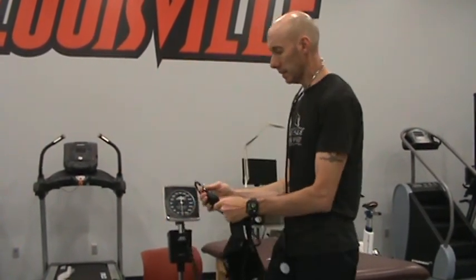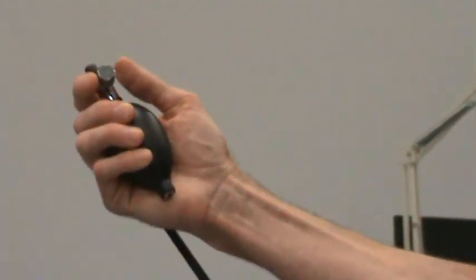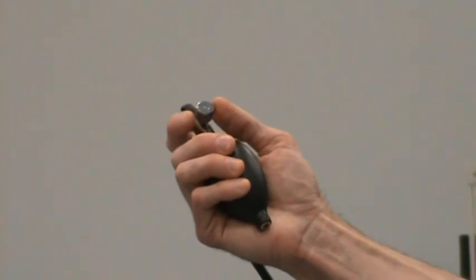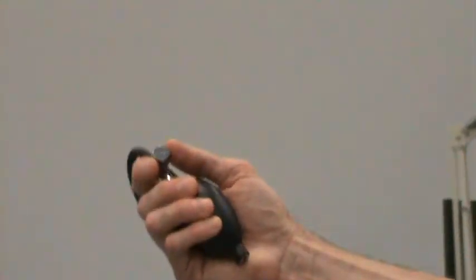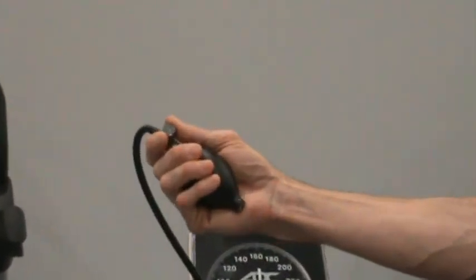So notice that there is a valve. I wanna have the valve pointing up so I can manipulate the valve with my thumb and forefinger in my right hand. Once I get the cuff placed on the subject, what I would do is close the valve. So I'm gonna turn this clockwise. Again, I don't wanna over-tighten it, just barely tighten it, and then I would pump with these fingers and the palm of my hand, okay?